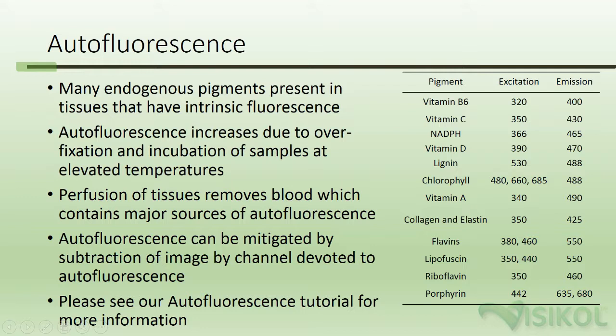Autofluorescence. Many endogenous pigments present in tissues have intrinsic fluorescence. Autofluorescence can increase due to overfixation and incubation of samples at elevated temperatures. Perfusion of tissues removes blood, which contains major sources of autofluorescence, and is recommended for larger tissues. Autofluorescence can be mitigated by subtraction of the image by a channel devoted to the autofluorescence channel. Please see our autofluorescence tutorial for more information.